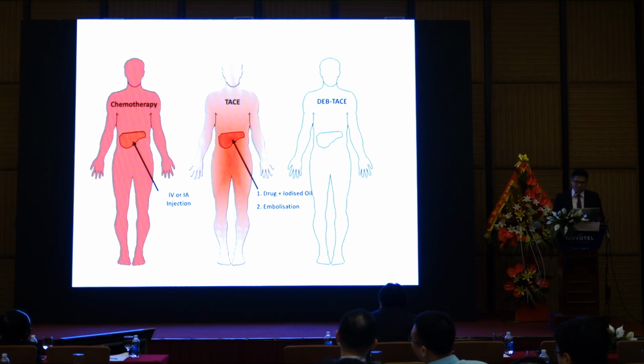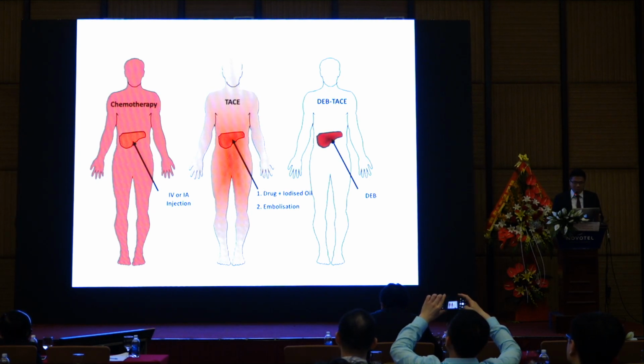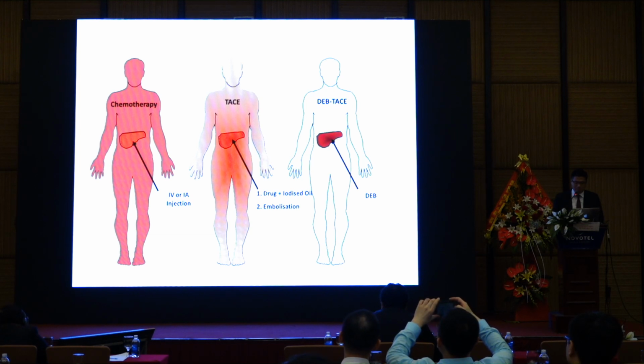But because it is based on an oil-based agent, early release of the chemo agent may cause liver toxicity and systemic side effects. For the pharmacokinetic characteristics of drug-eluting bead TACE, the beads can hold the drug very tightly and cause a slow release and high concentration of the intratumoral dose. So that should be better for the cytotoxic effect and embolic effect for HCC.